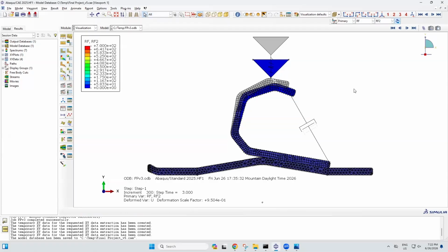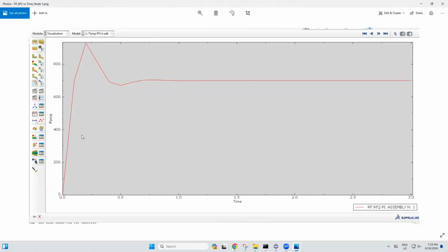Now, I plotted the reaction forces versus time, and I also plotted the horizontal and vertical displacements over time. The reaction force will originally be larger than 700 because the part is decelerating on the way down, so the ground is producing a larger force, but then the reaction force will be below 700 as the part accelerates upwards to equilibrium. This is shown right here where it goes below 700, and then as the part reaches equilibrium and stops moving, we see that it levels out at around 700.